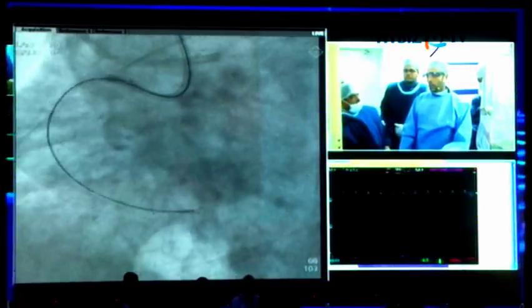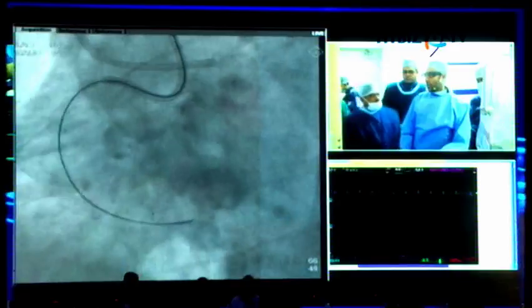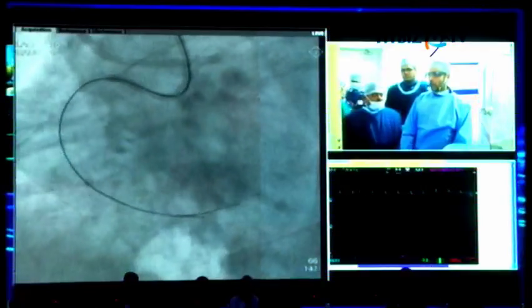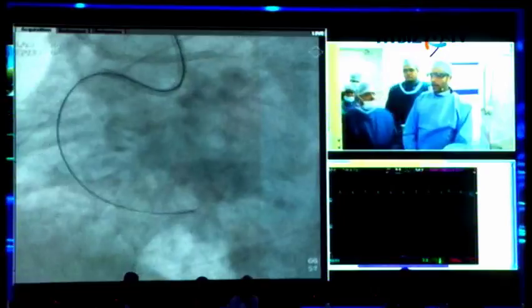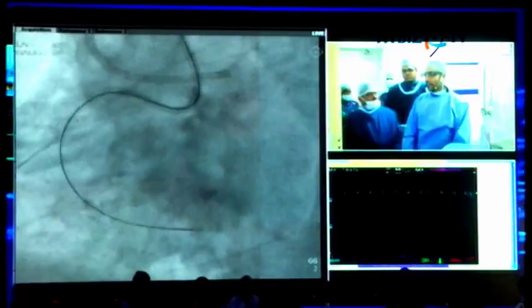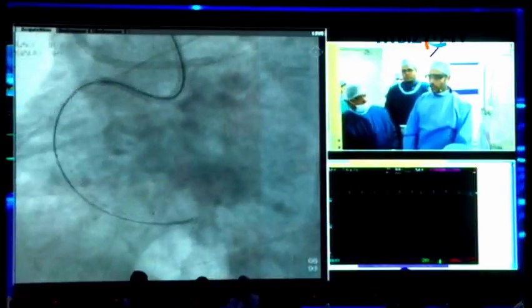What I did was I just took my, which wire? Stingray wire. Okay. I just took it down the vessel. It's a diseased vessel. There was some distance. I got a good splay. I went with feel. The whole idea of doing ADR is to make it reproducible. In general, I don't like saying, oh, I just felt it and I went. But this is one of those instances where you did what you had to. So we just stuck it, went forward.